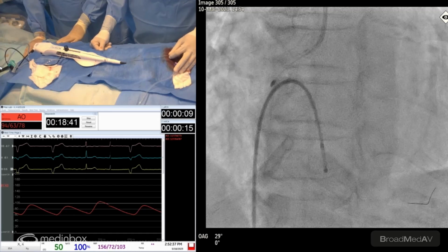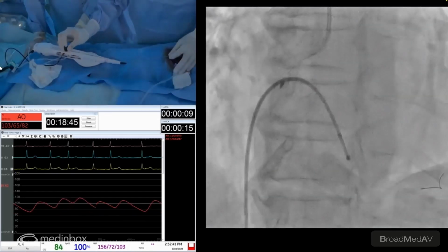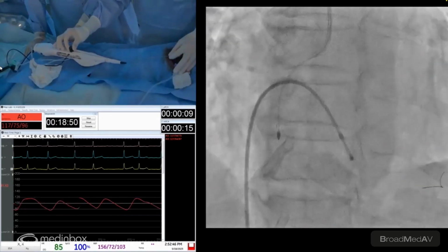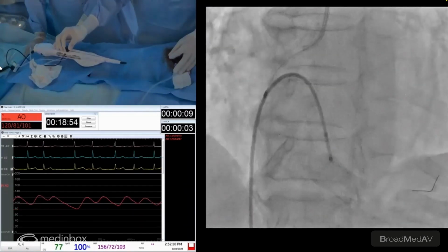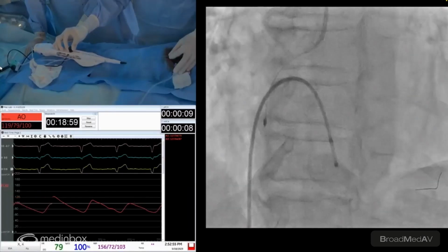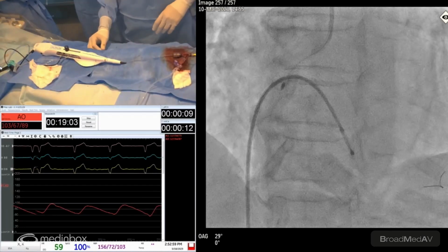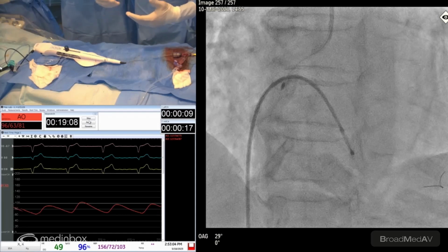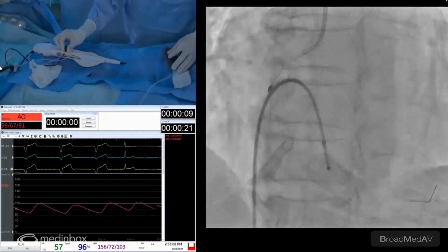So it was definitely a good call doing an atherectomy here and putting a pacemaker in. Yeah, sometimes you hesitate. But you know the famous saying of rota regret? I try to avoid that as much as I can. Usually when you hesitate, it always means that you should do it. And the more you do it, the more you become familiar with it, and it just doesn't take longer than bringing up multiple balloons and multiple predilatations.